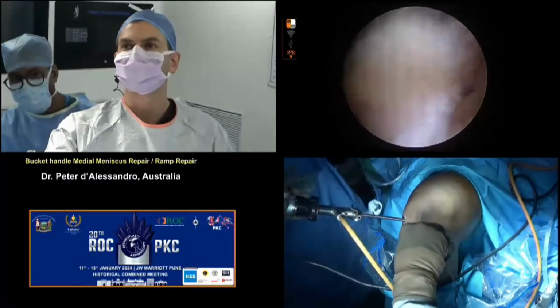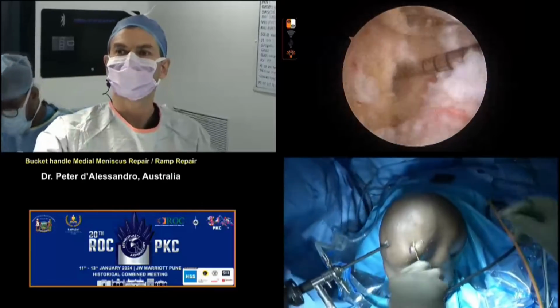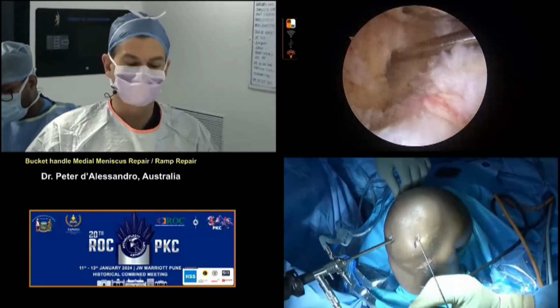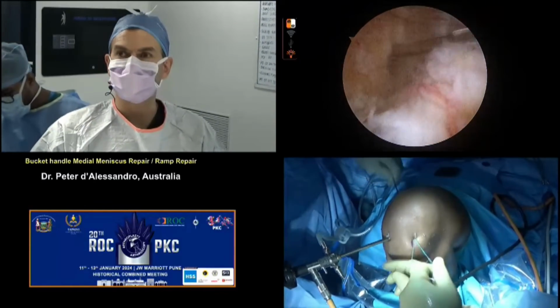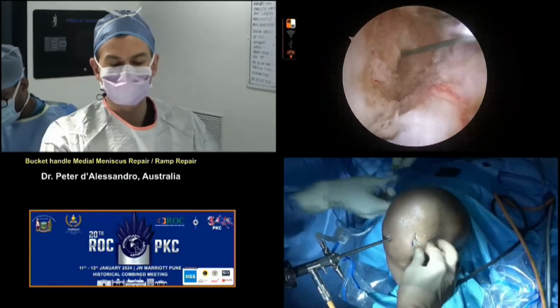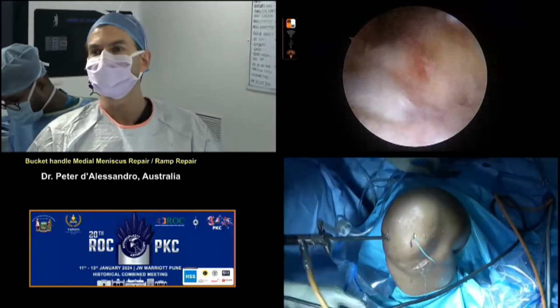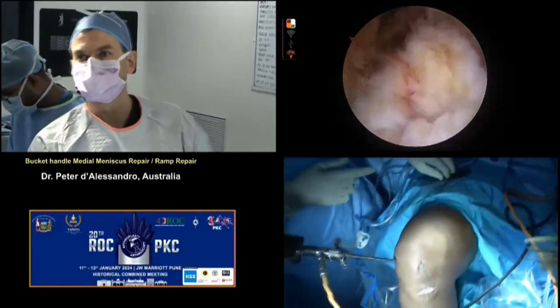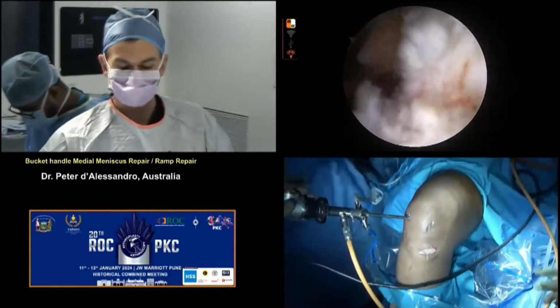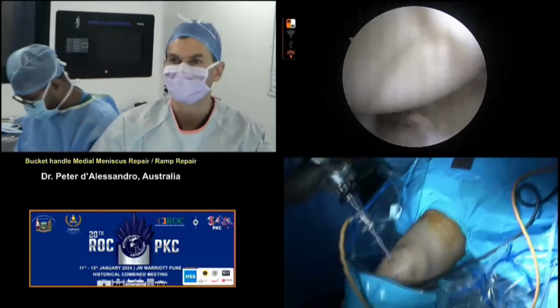Peter, would you change the position of your tibial tunnel if the patient has got a hyperextension, depending on the type of hyperextension he's having, or is your standard tibial tunnel always the same? Yeah, I'm trying to replicate their anatomy, the centre of the stump is what I'm aiming for. That said, I certainly try and get as anterior as I possibly can, but I don't tend to move it around a great deal. If I have a hyperextender, for me it's graft choice that makes the difference. So we've got our tunnels ready to go here. We're going to go to the medial side of the knee now.